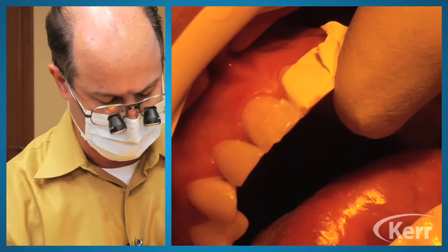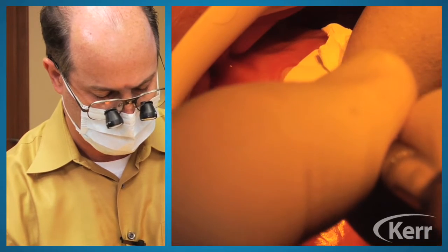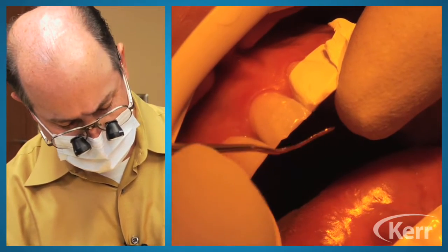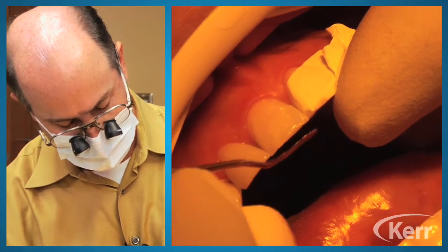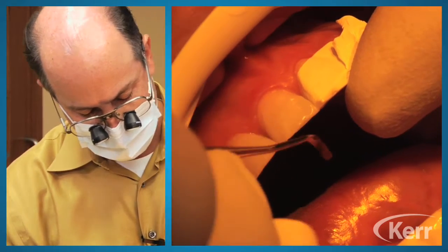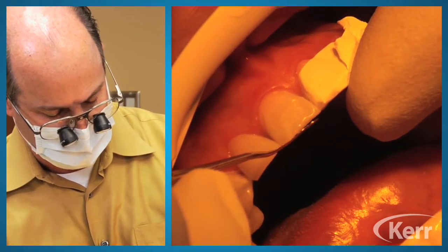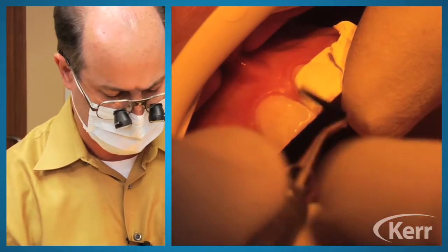What they've done is put in some nanofillers in this, hoping that because of the nanofiller particles in the Herculite Ultra, borrowing from the same chemistry of Herculite, that will in fact have the great strength that Herculite has had through the years, but a little bit better handling properties, and a little better polishability would be nice, especially the maintenance of the polish. I would rarely today use Herculite on an anterior tooth, but certainly I use it on lots of posterior teeth.